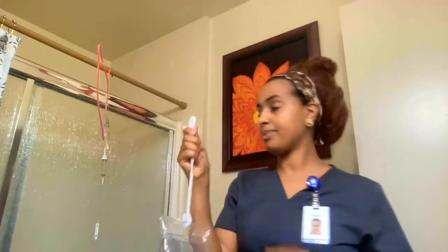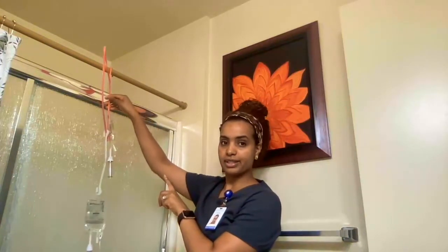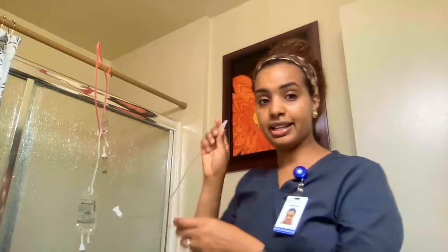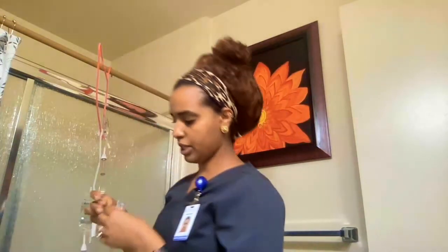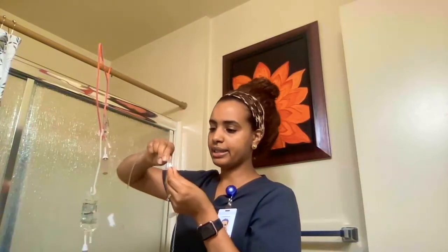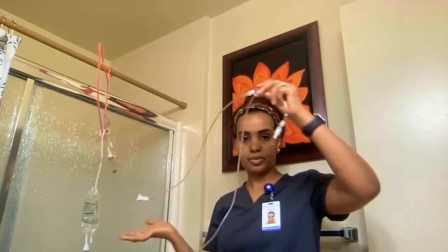I have my extension tubing. As you can see, my primary bag is hanging up, and this is my secondary bag. I'm going to take the tip off the secondary tubing, get my alcohol swab, and clean the tip. Then I'll connect the secondary bag tubing to the Y-site on the primary tubing. This will then go to the patient's IV site.